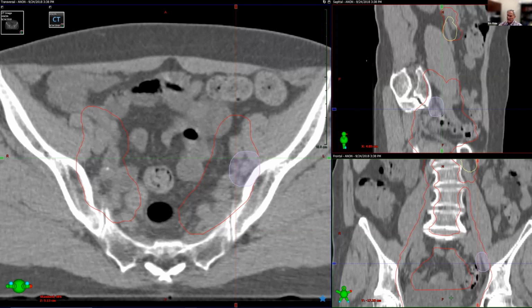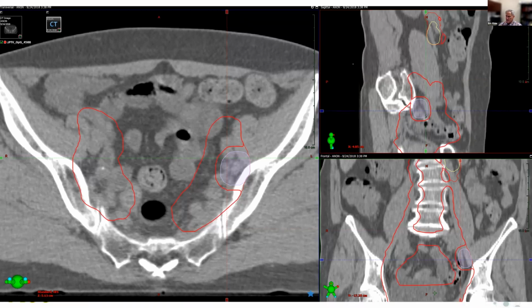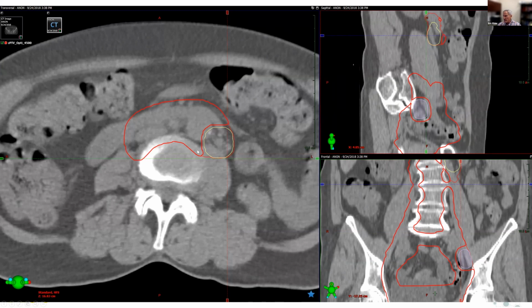So what does that look like? Here we see our PTV 4500 and our PTV 5500 in all 3 planes. When you construct this new PTV opti 4500, you're going to see that you've pulled back with about a 3.6 millimeter margin away from that PTV 5500. You'll use this for your PTV optimizer. And here it is as well with your 5000. You can see the margin's a little less for your 5000 because you're only going from 5000 down to 4500, so you can have less margin. You can be assured that the dose is going to be fine in here because this is going from 5000 to 4500, so you should have no problems with it, but it allows your optimizer to perform better.